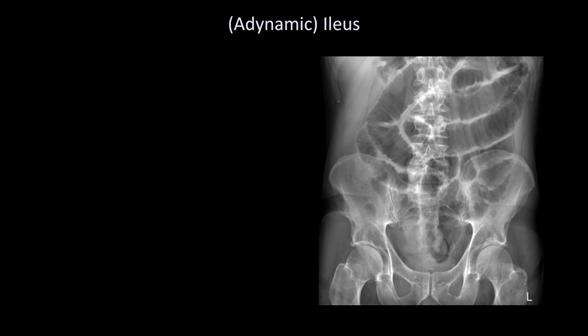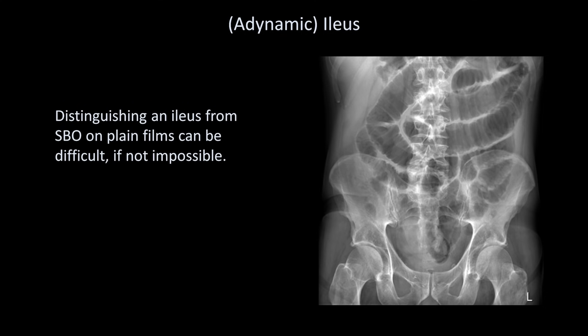Here's a supine film in a patient with something called an ileus, which in common usage is used synonymously with adynamic ileus, in which there is an absence of normal peristalsis leading to bowel distension. Distinguishing an ileus from a mechanical SBO on plain films can be difficult, if not impossible. Often the clinical context is necessary to distinguish them, in that a mechanical SBO is usually the reason a patient presents to the hospital, whereas an ileus usually develops after the patient has already been admitted for something else.